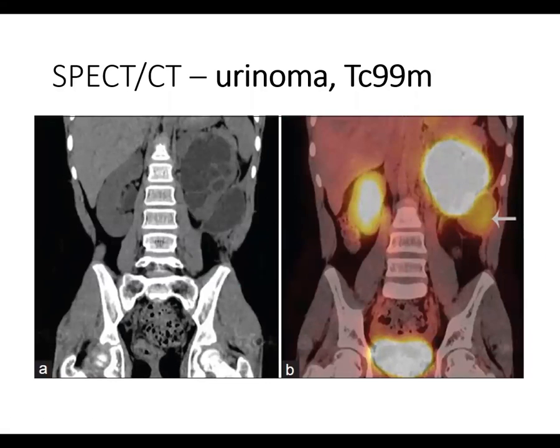If we look at this image, on the left side we see the computed tomography. We can see an abnormal lesion in the region of the left kidney, and a lot of anatomical details, sharp details. We can see vertebrae, musculus psoas, right kidney parenchyma. This is the pelvis of the right kidney, liver, spleen, pancreas, ribs, diaphragm, urinary bladder. This is the bowel, and gases and feces inside the bowel. So very useful information from an anatomical point of view.